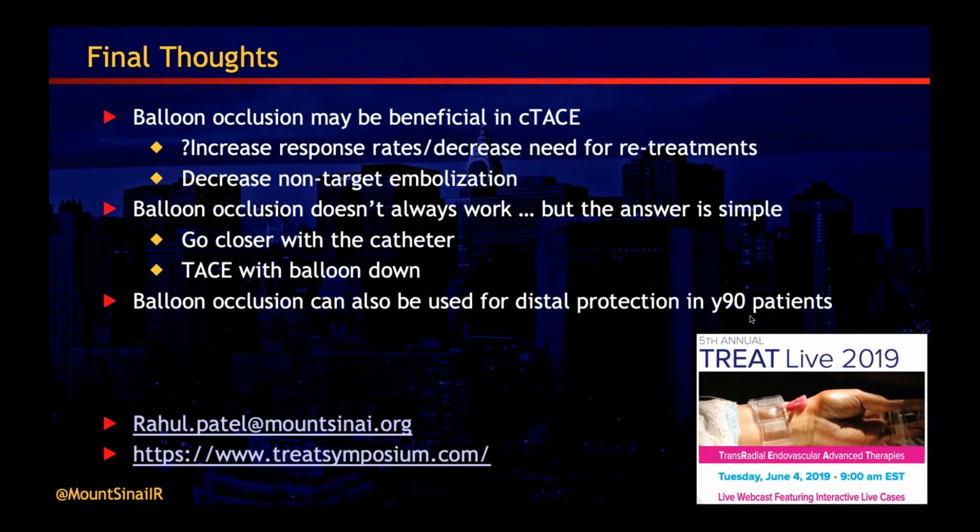Balloon occlusion may be beneficial for distal protection in Y90. You can also use it for proximal protection as well, although we haven't really used it in that setting yet.